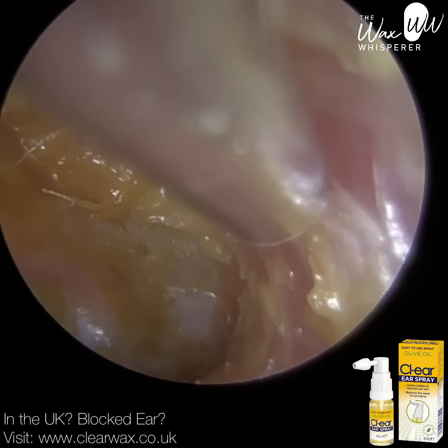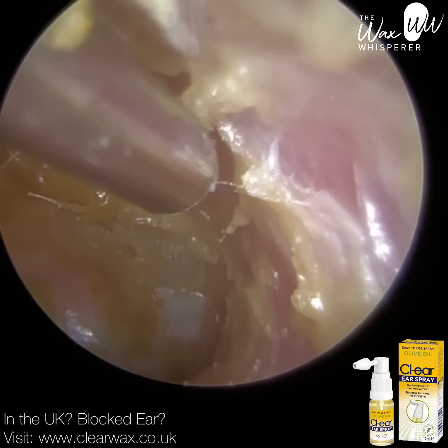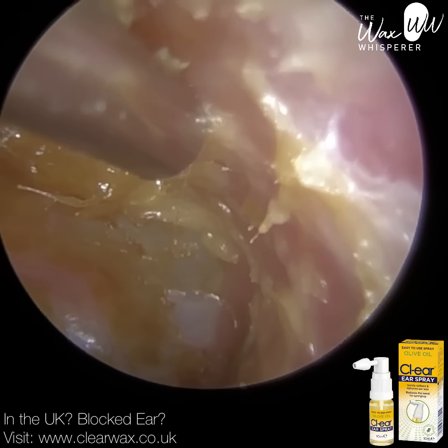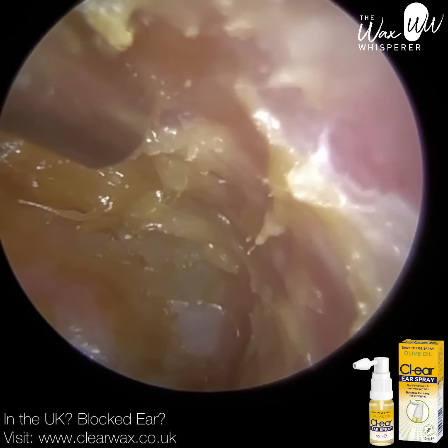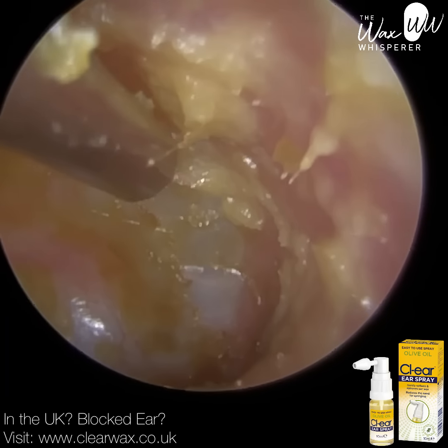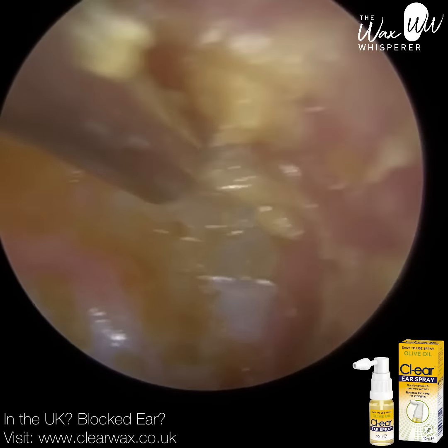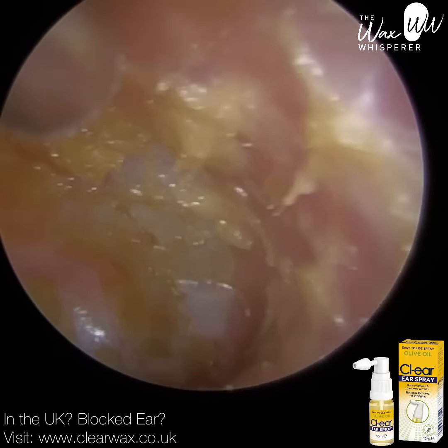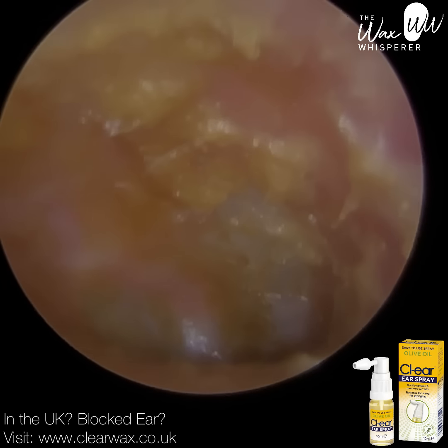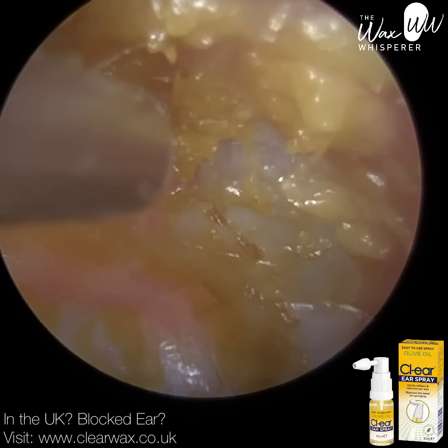Also, a lot of questions we get asked... I'm just letting you watch the video whilst I'm talking a bit off tangent. So I'll just summarise what we're doing. As you can see, the eardrum's fully visible now, and I'm trying to get as much of this sticky debris discharge, dead keratin off the canal wall and off the eardrum as I possibly can, as safely as possible.